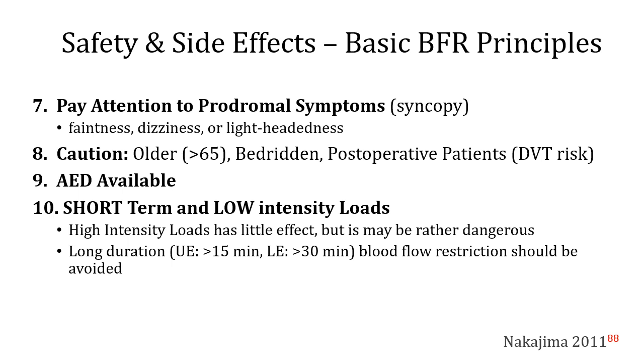Short-term and low intensity loads are ideal, particularly when first starting out. High intensity loads have little added benefit, but may actually be rather dangerous as far as the hemodynamic and blood pressure responses, particularly if it goes on for an extended duration of time. Longer duration: upper extremity greater than 15 minutes, lower extremity greater than 30 minutes.